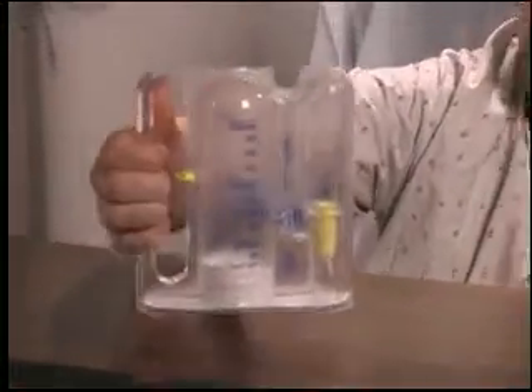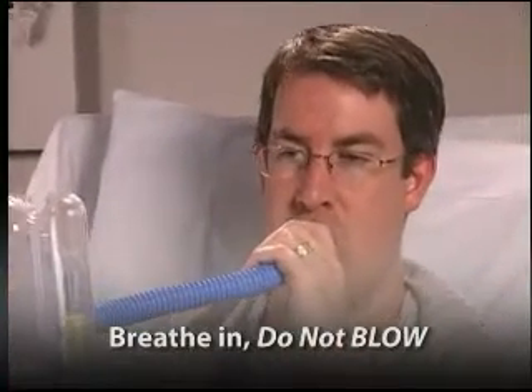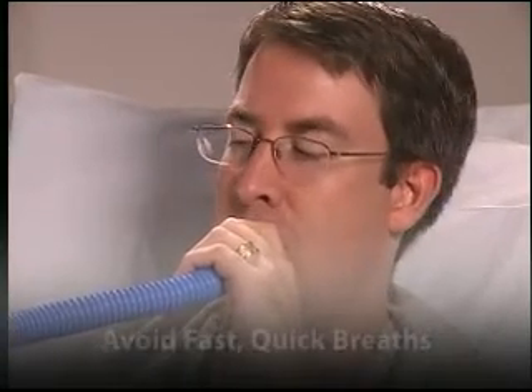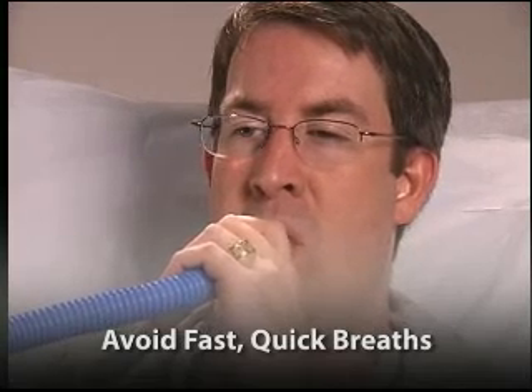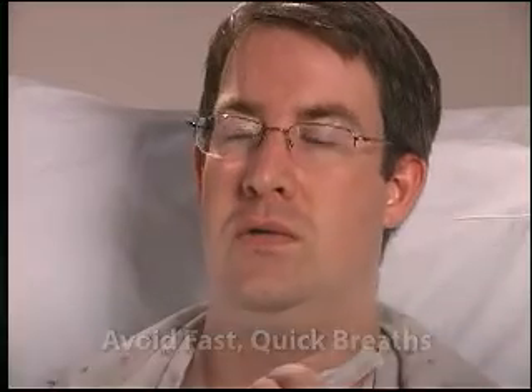A common mistake is to blow into the device — breathe in, do not blow. The goal is to open your airway and fill your lungs with air. Also avoid fast, quick breaths, as this may cause certain areas of the lungs to expand more than other areas and be more tiring.